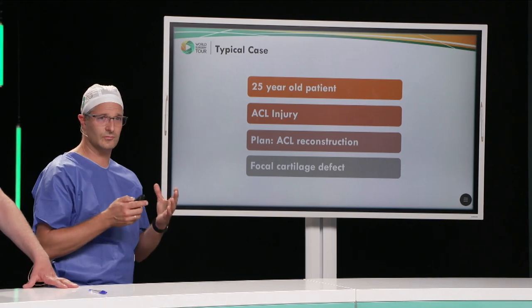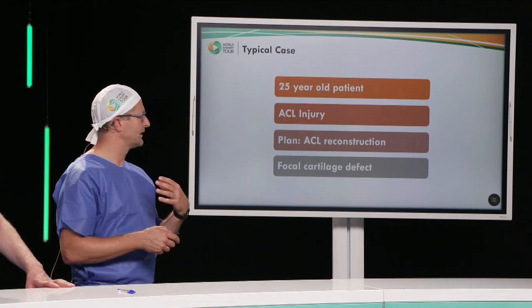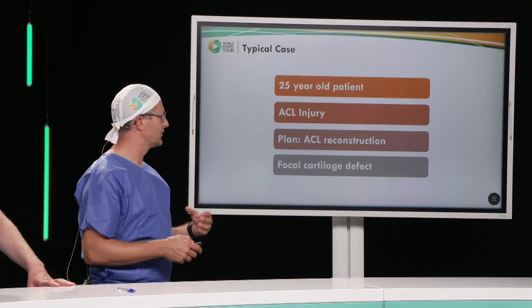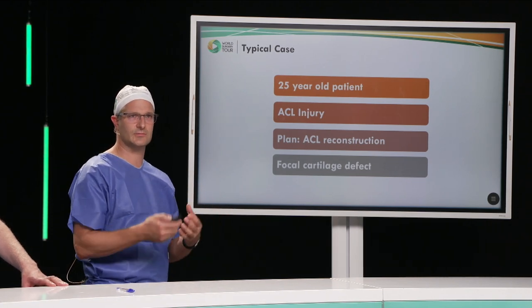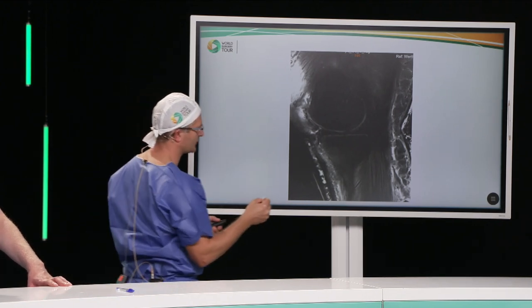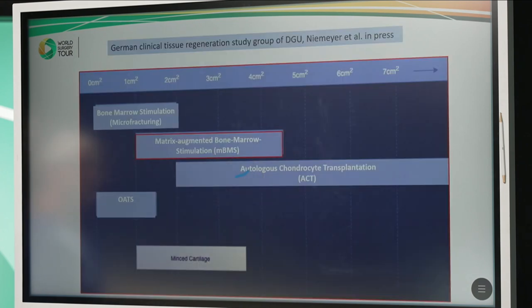So this patient we're going to see today, or we try to simulate today, is a classical 25-year-old, a young patient who had suffered an ACL injury. And besides the ACL injury, he also has a focal cartilage defect. And ideally, we would like to repair both the ACL and the cartilage at the same time. So this is a patient you might see with a small focal damage right here. And this is a perfectly contained defect. It's a focal defect. So these predispose the patients to a very favorable outcome if they are repaired in time and to prevent any arthritic changes later on.